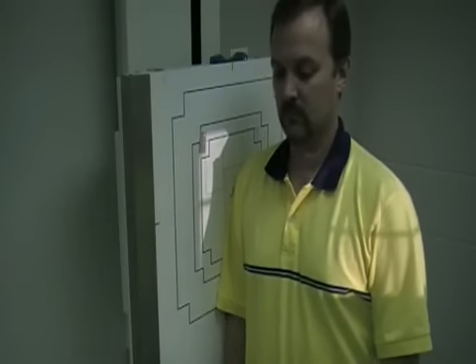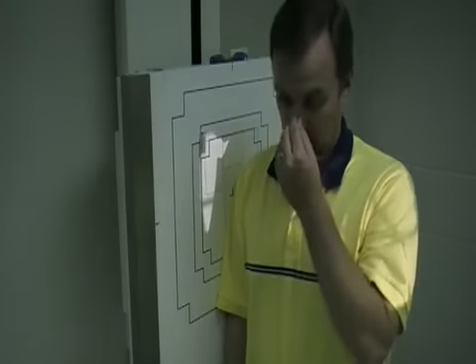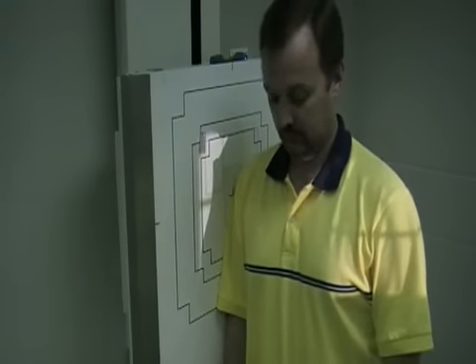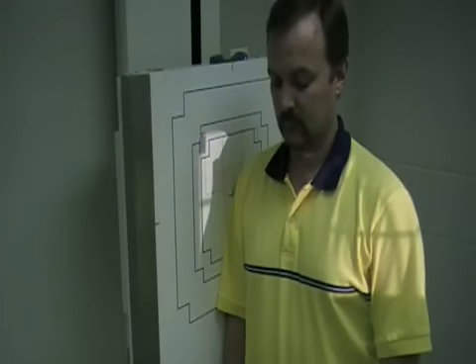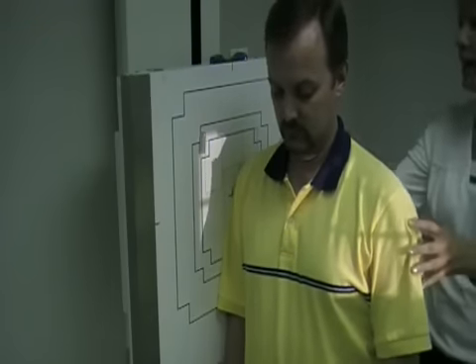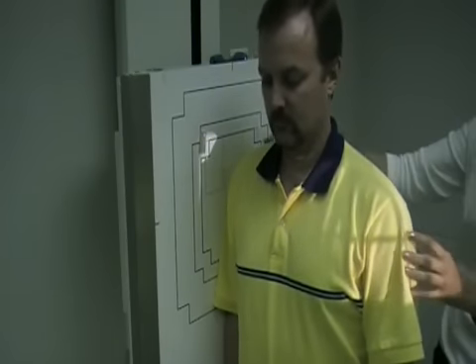Next, we will do the transthoracic shoulder. This is for the patient that is not able to do the arm rotation for the AP shoulder. So in that instance, you'll have the patient put the affected arm against the IR. We only need a 10 by 12 image receptor in lengthwise.